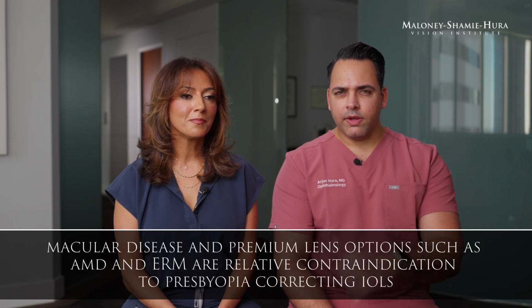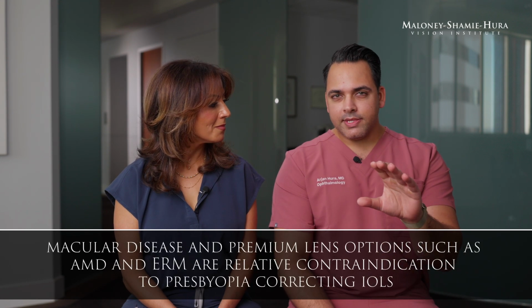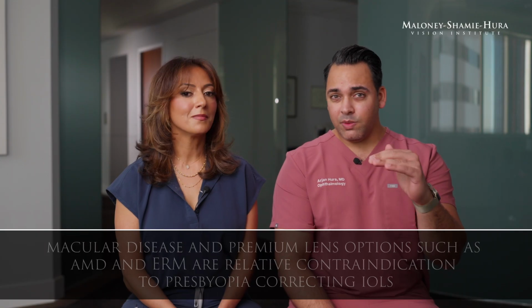Yeah, I think those are all fantastic points. And maybe just one final key element I think both of us really pay close attention to is what is the patient's visual acuity? And this is true for whether we're thinking about cataract surgery, refractive lens exchange. If a patient comes in and their best corrected visual acuity is 20/20 or even 20/15, I really pause when thinking about whether or not they would do well with an advanced lens, because we know that by virtue of how these optics of multifocal or extended range lenses work, there can be a slight reduction in contrast sensitivity, and we see that with the defocus curves.